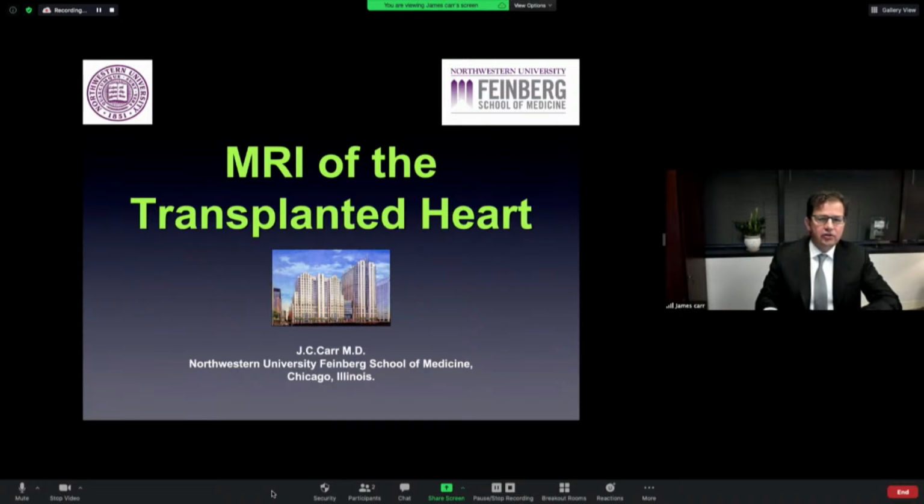Great, so I'm going to talk to you on MRI of the transplanted heart today, and this is just initially a quick summary of what that entails, but then most of the talk is going to be presenting other people's data and some data we have from Northwestern. I'd be curious to compare notes at the end.